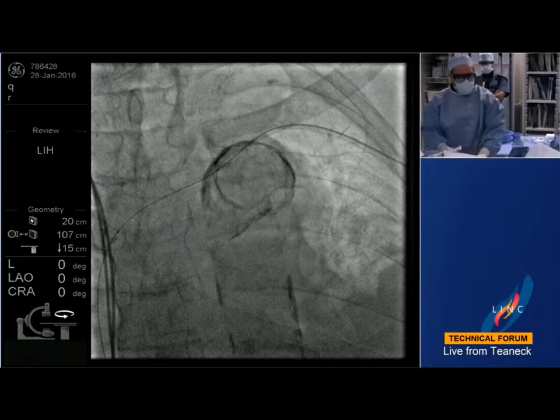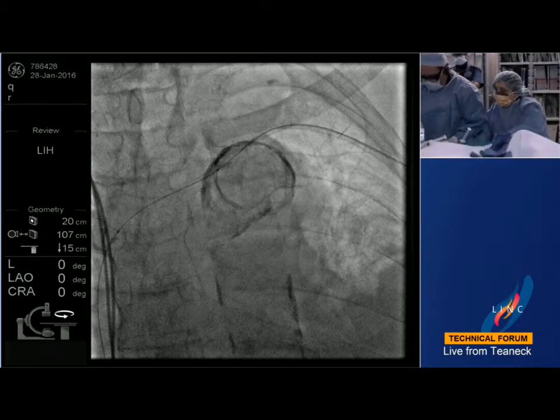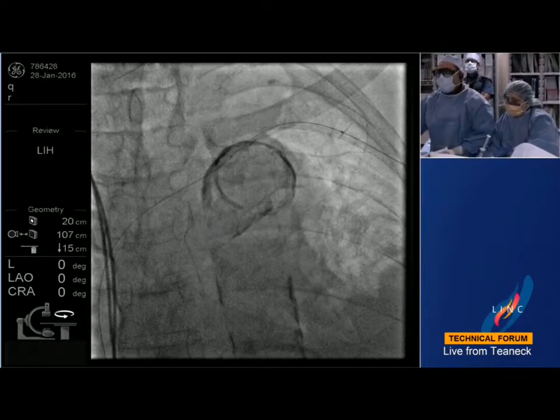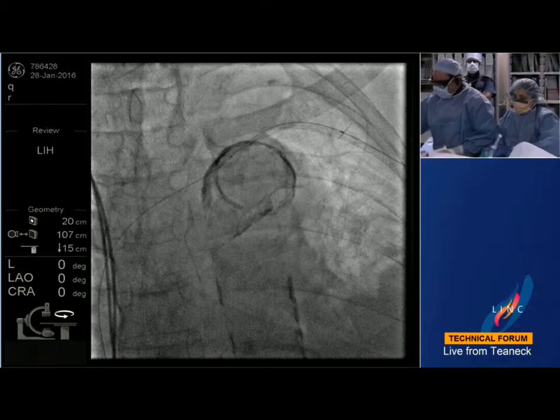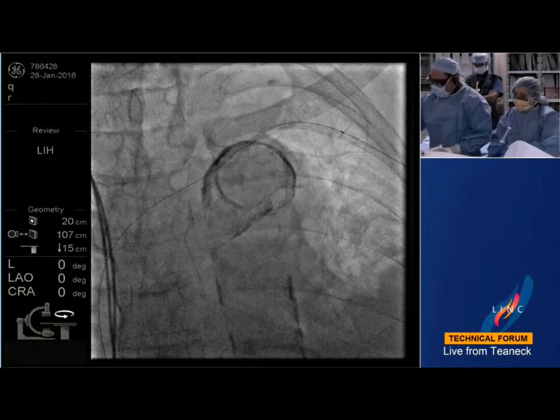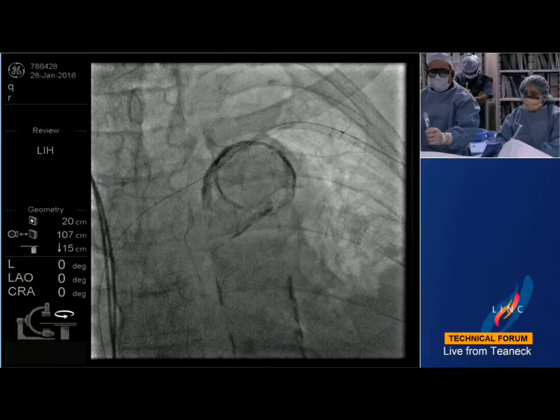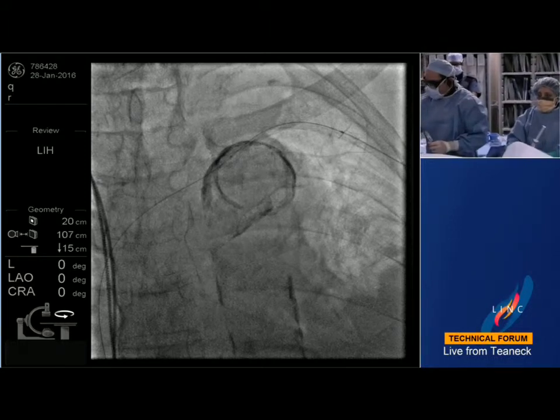I think one potential option is to take where the outflow is good at the brachial and just bring that to the radial artery a little more proximal, or to the brachial artery, and now just convert it to an upper arm fistula where you're above the areas of continued recurrent stenosis. That would be one surgical option. Right. Sure.